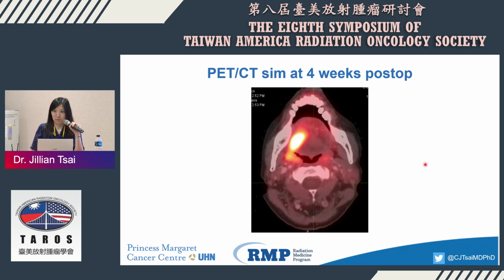And this can be a post-operative change, or it could be recurrent, right? And typically when you discuss a case like this at tumor board, surgeons get very upset because they say you are accusing them of incomplete surgery. It can get really personal. So it depends on the comfort level of the team. But I have to say, if you have read post-operative scans enough, you can kind of tell, and also by the exam of the patient.